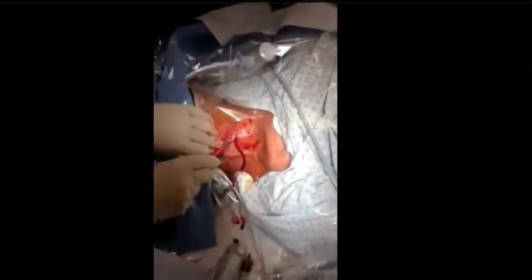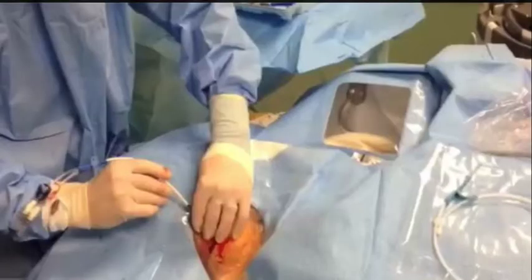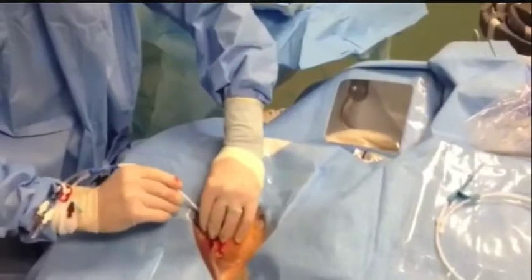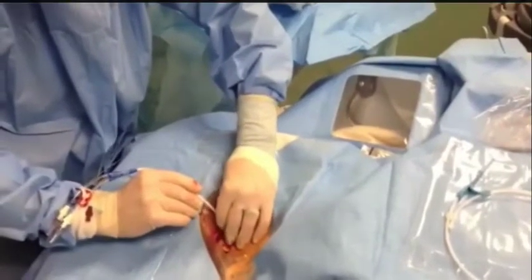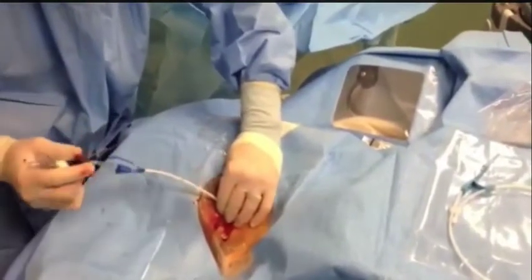The next step is removing the needle over the wire, and then making a small nick in the skin with the scalpel to allow the dilator to enter the skin easily. The dilator is then inserted over the wire. Once dilated, the catheter can then easily pass over the wire. You must be careful to control the wire that comes out of the open port, and have control of the wire at all times.